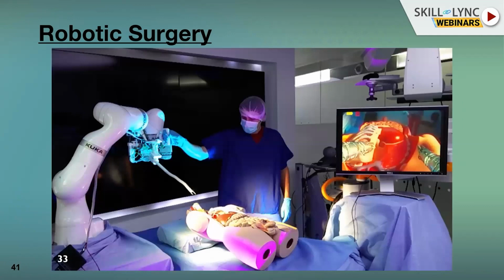Okay, so here you can see the doctor is performing on a dummy. Usually the doctor has to get trained on the robotic surgery equipment, so that they can actually perform, because it is not like a simple surgical equipment. Okay.